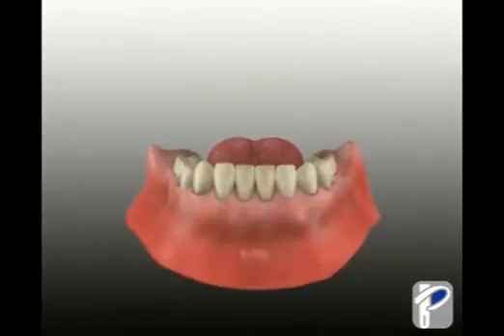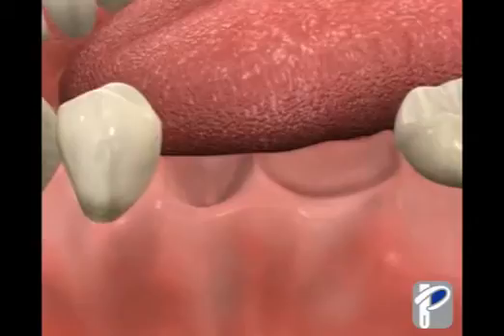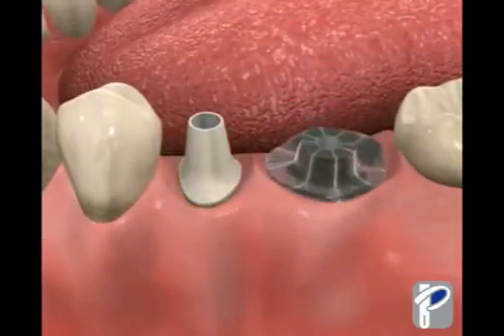Nobel BioCare implants and a Procera bridge can solve this problem, giving you back the ability to eat whatever you want. This clip shows the loss of two posterior teeth. To restore this area, the bone is prepared and implants are placed in the sites.